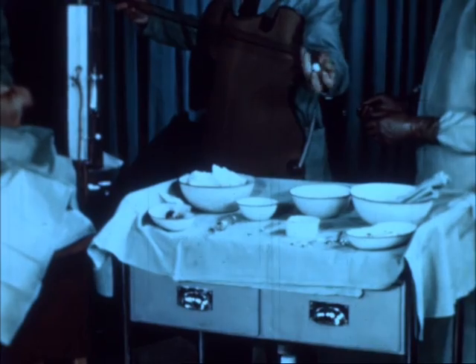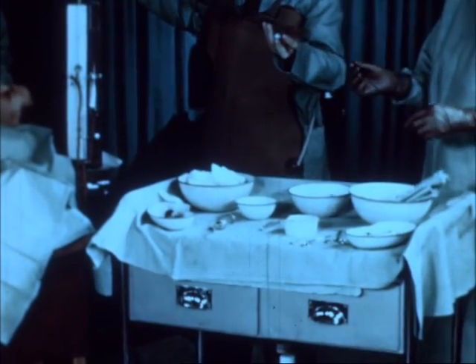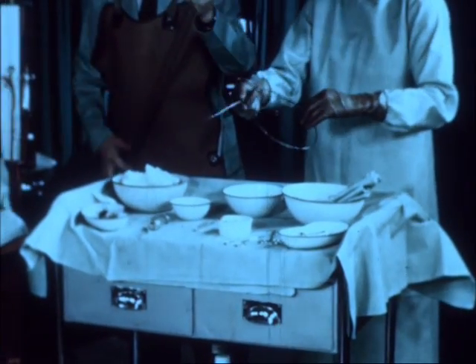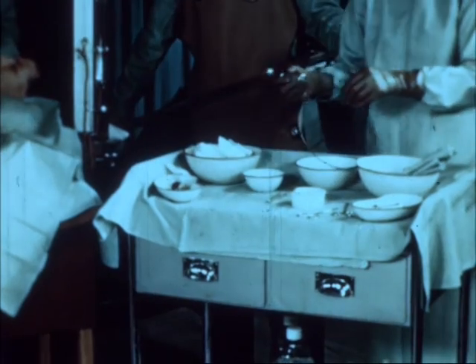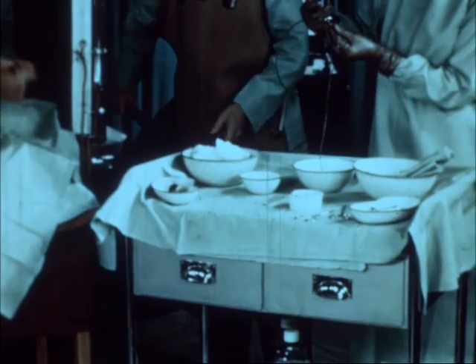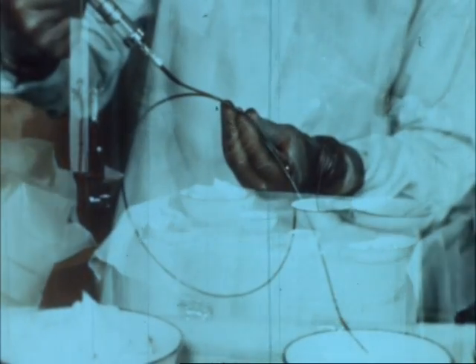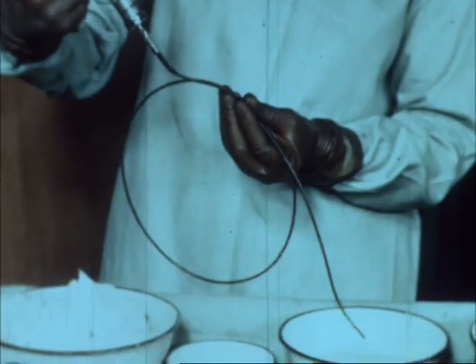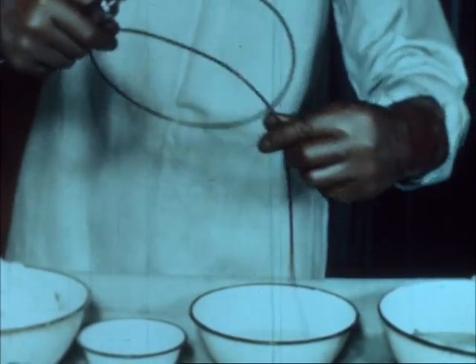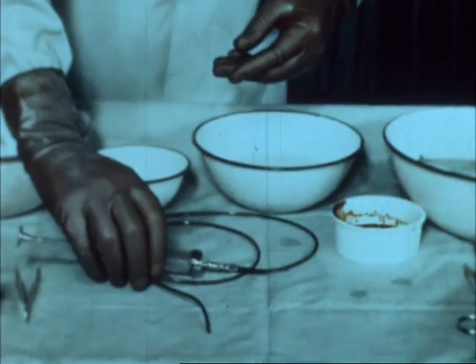Now let us return to our demonstration. Catheterization of the heart must be carried out with all sterile precautions. A sterilized catheter is taken from its storage tube. A syringe is attached and the catheter is flushed through with saline solution. It is then ready for insertion and is placed in an accessible position on the sterile instrument tray.